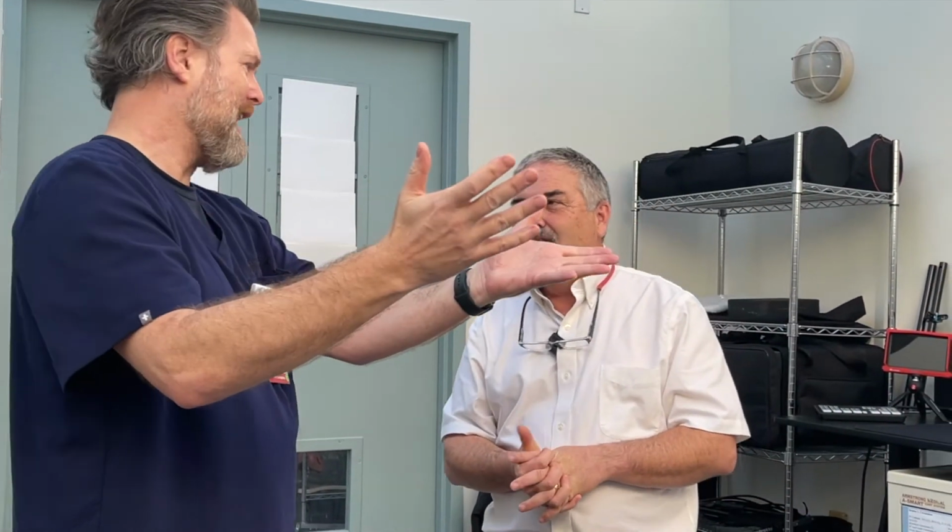Yeah. Now I look up on the screen, and for someone who started off with DL, with my GlideScope, I've got this big high-def screen, and I'm like, oh my God, look at this! How can I not be able to intubate this patient? It's staring me right there in the face. But in fact, that's actually wrong. It turns out it's wrong.